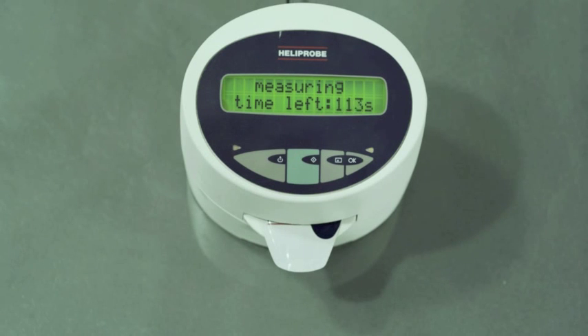Press the green button to begin the analysis and wait for the results. After approximately 4 minutes the instrument will beep, indicating your results are ready. A test result value of 0 indicates that the patient is not infected with Helicobacter pylori.